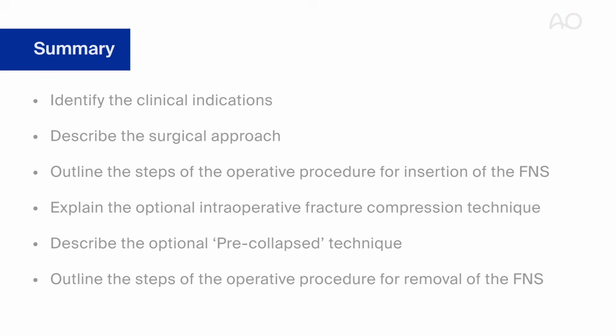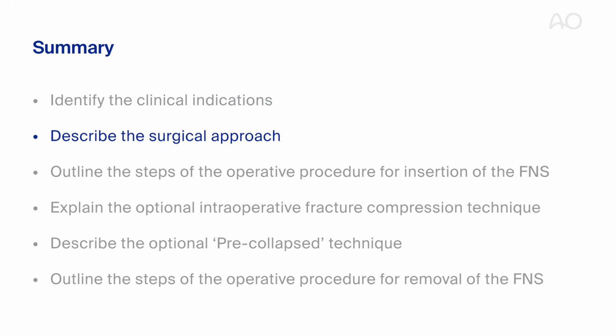You should now be able to identify the clinical indications, describe the surgical approach, outline the steps of the operative procedure for insertion of the FNS, explain the optional intraoperative fracture compression technique, describe the optional pre-collapsed technique, and outline the steps of the operative procedure for removal of the FNS.